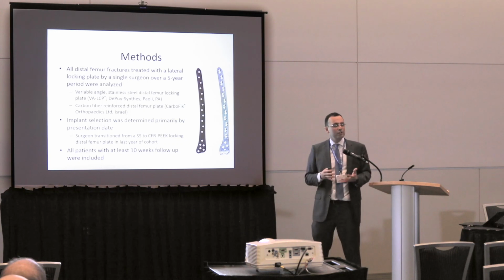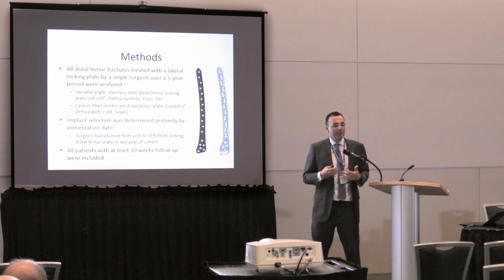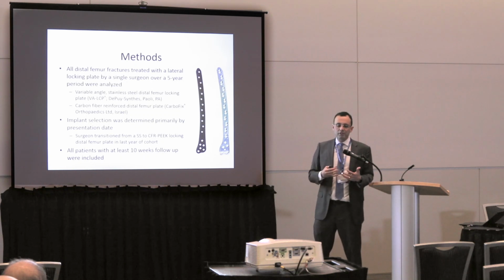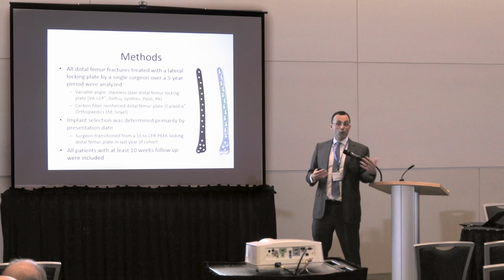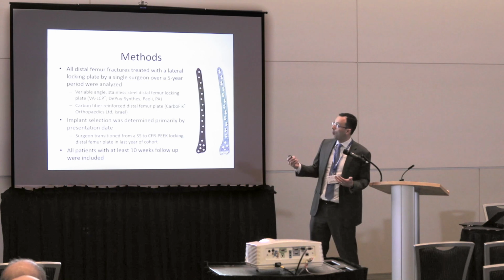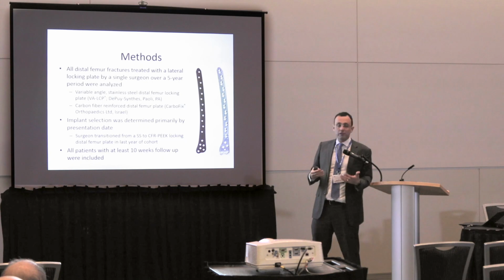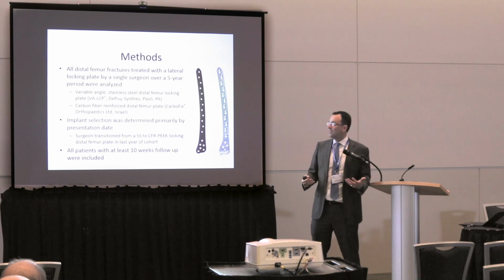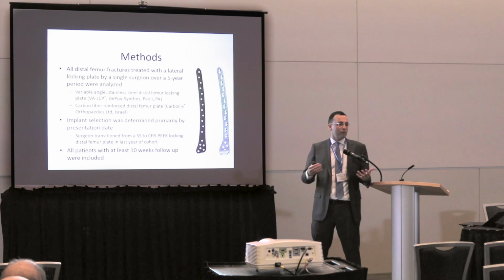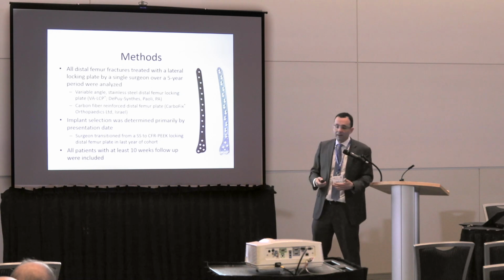What I essentially did was take my distal femurs that came in when I was on call, and I used the CarboFix plate. Then I could compare those patients to the 3 or 4 years before that, when I used exclusively stainless steel plates, all Synthes. The implant selection was really determined by the time the patient came in. I ended up with several cases, and I looked for the ones with follow-up of more than 10 weeks to see how they did.